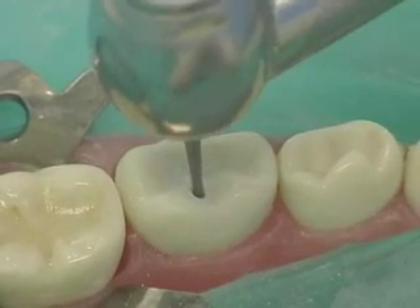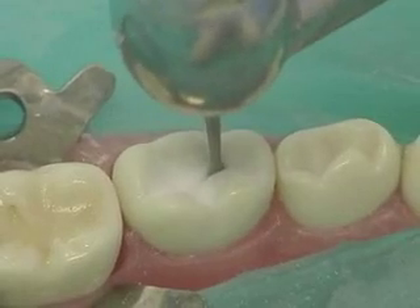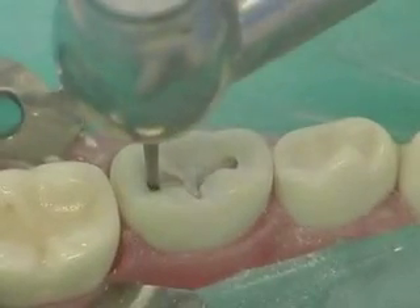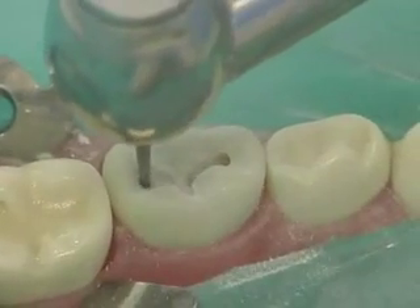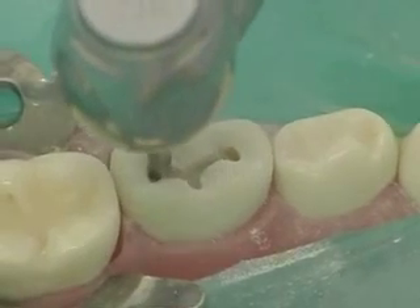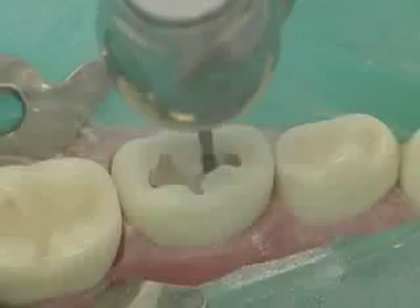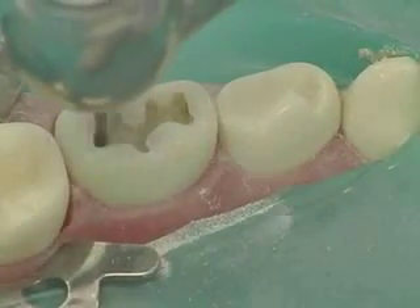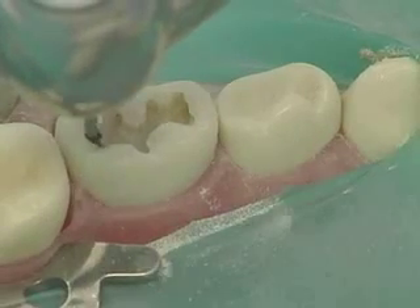Begin the outline form in gentle arcs and curves. As you work on each wall, the handpiece head should be tipped to parallel the external surface. Here we begin with the lingual wall, followed by preparation of the buccal wall. Continue to the distal margin, directing the preparation toward the contact point until you have undermined the distal marginal ridge.